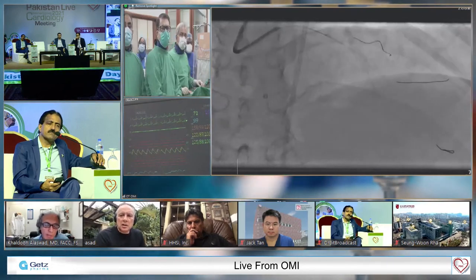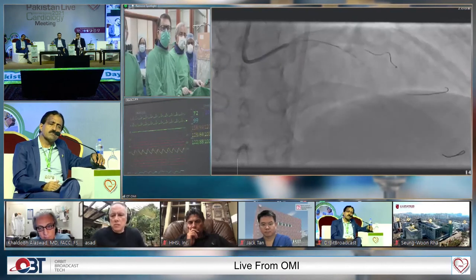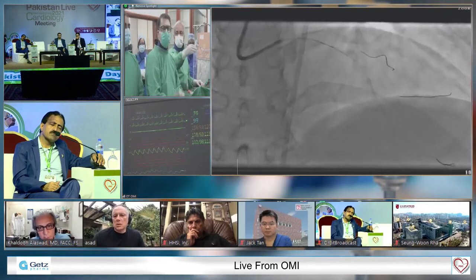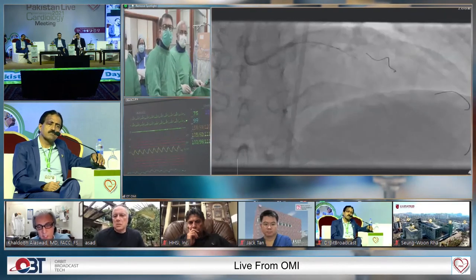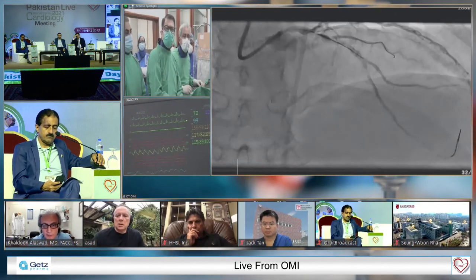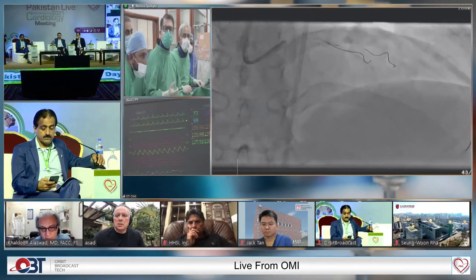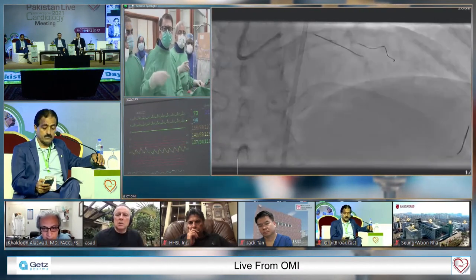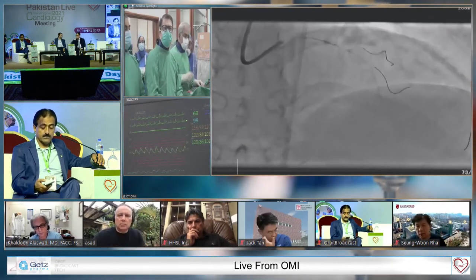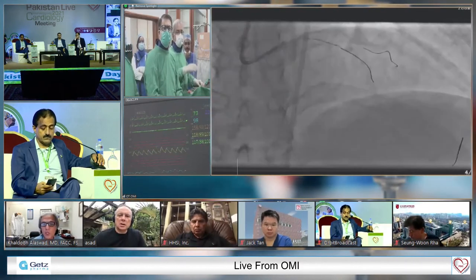I'm worried this is a wire bias. It's not a real lesion in the ostial D2. So if it's only wire bias, you can just stent across it if you need to, and leave the wire there. But the way to figure that out, you have to pull back to the soft tips. It might not be a wire bias, but if it's a real lesion, I would dilate it with a 2 millimeter balloon. So you don't want to do a two stent technique. You just want to relieve the spasm with a little ballooning and then stent just one stent across both of the diag.